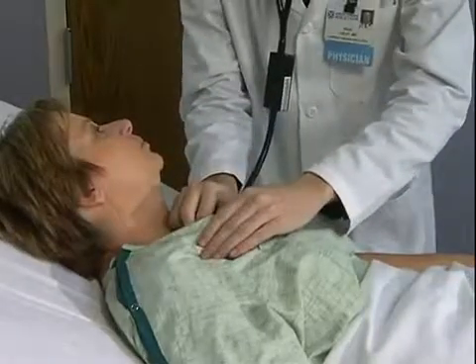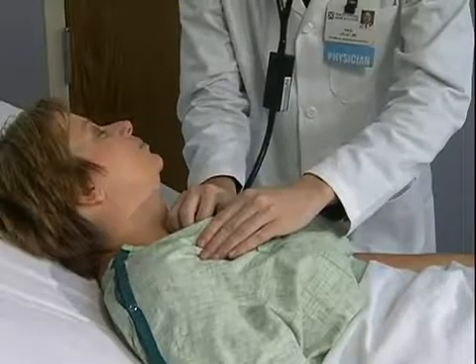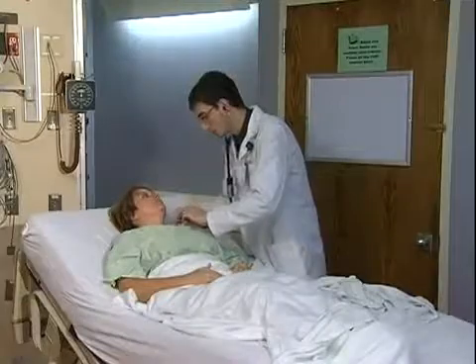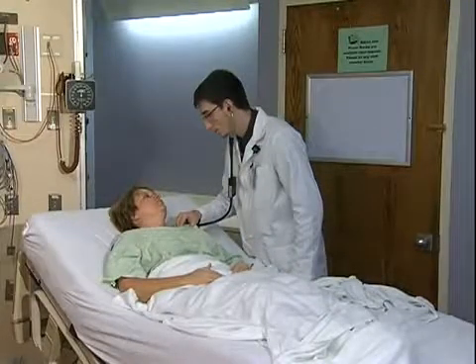Good timing is important to create the most realistic experience. The standardized patient should press the button at the instant the stethoscope touches the body and release at the moment when contact is broken.